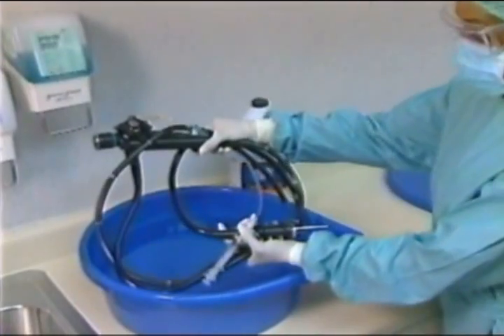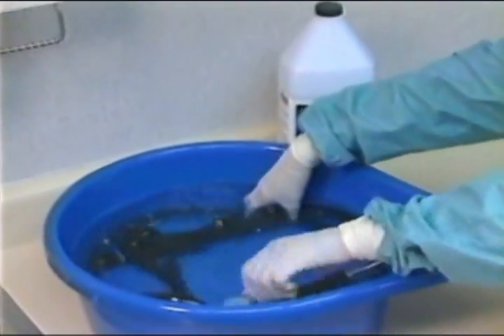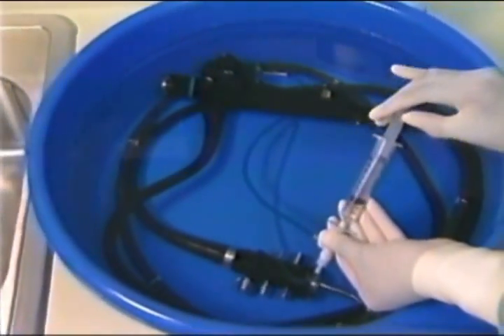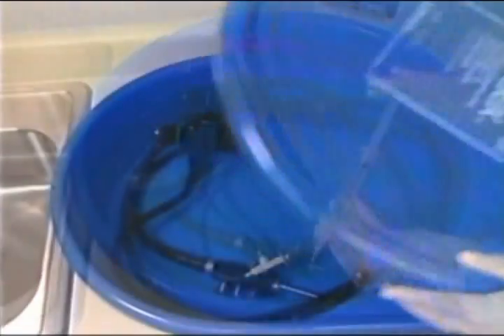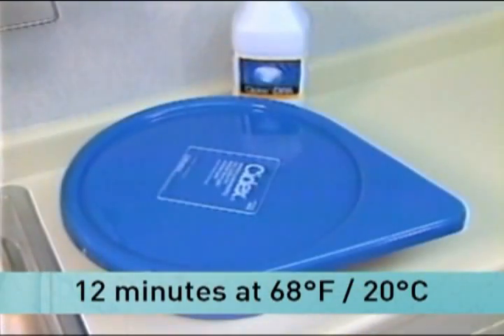Immerse clean, dry instruments in the Cydex OPA solution. Ensure all instruments are completely submerged and, if applicable, fill all lumens. Cover the tray with a secure lid. Soak for just 12 minutes at 20 degrees Celsius to achieve high-level disinfection.